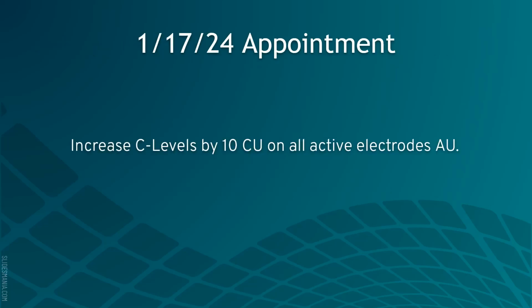So the patient came back for a second follow-up on January 17th, 2024. A lot of this was just to address some of the speech in noise and to give more of a separation, more gradients between soft sounds and loud sounds. The only real change that we made was we increased C levels by 10 CUs on all active electrodes on both processors. Some of those high-pitched electrodes, which didn't have a great dynamic range, we made that dynamic range a lot more ideal.